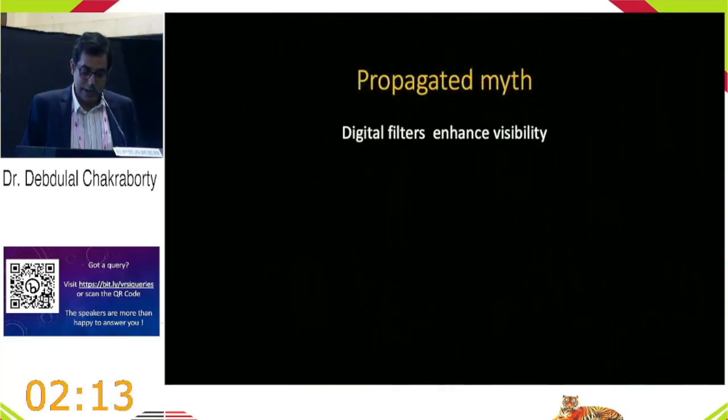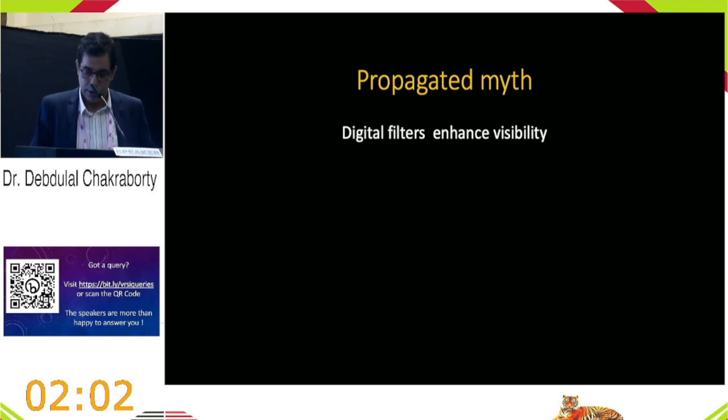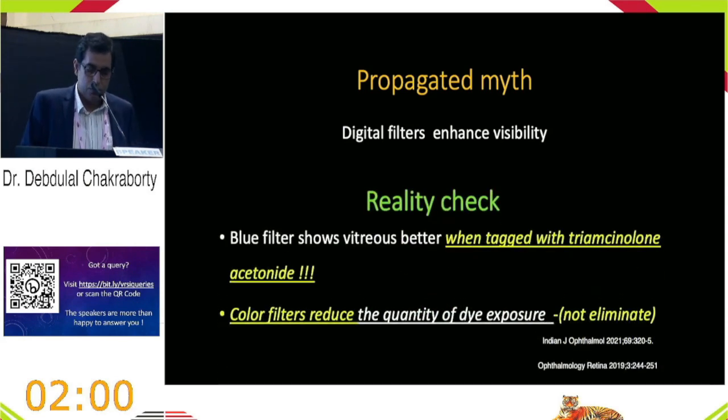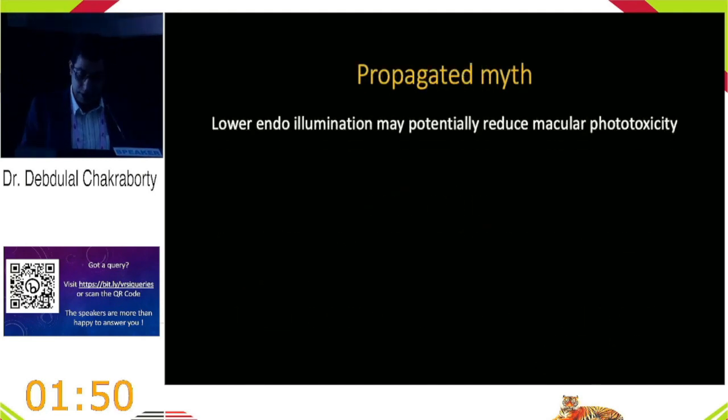Let's move on. The next propagated myth: digital filters enhance visibility. My friend Srinivas himself said you need a lesser amount of dye or triamcinolone. You can't do away with it. So why use this? Blue filters actually show the vitreous better when tagged with triamcinolone acetonide. Color filters reduce the quantity of dye exposure. This is all published literature, not my saying. Lower endo illumination may potentially reduce macular phototoxicity.